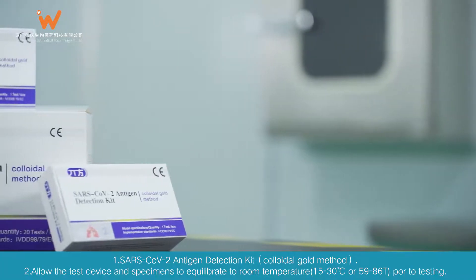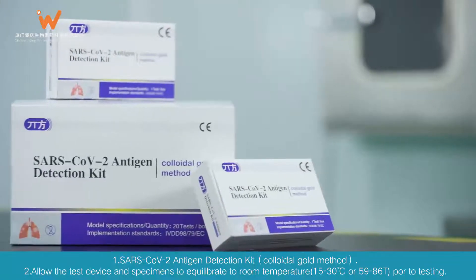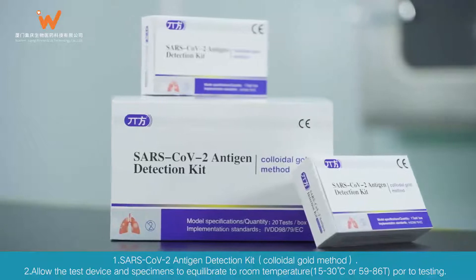SARS-CoV-2 Antigen Detection Kit, Colloidal Gold Method. Allow the test device and specimens to equilibrate to room temperature, 15–30 degrees Celsius, or 59–86°F, prior to testing.